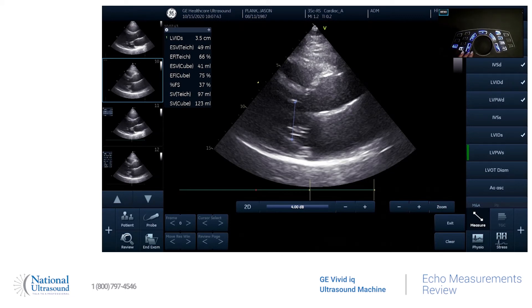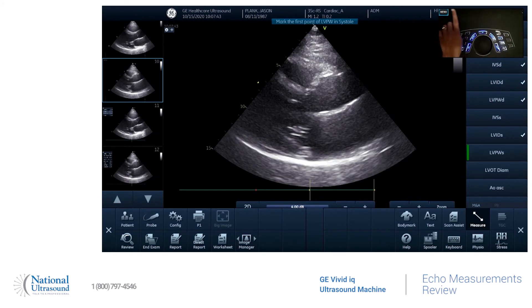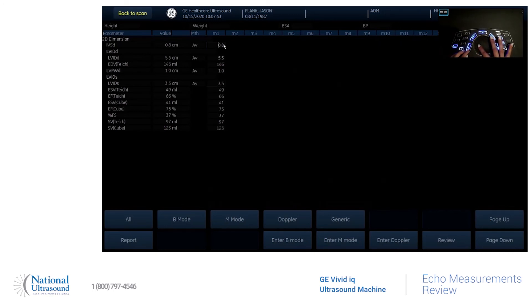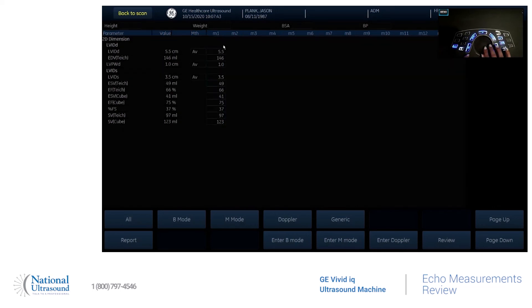And if you were to need to delete any measurements, you can either press this clear — it'll delete the ones that are on the screen. Or you can go to your options here, hit your worksheet, and all of your measurements are going to be listed. If you were to need to delete a value, you can hit the update button, then hit delete value or delete set. So if you want to just delete the one value, that'll be gone.